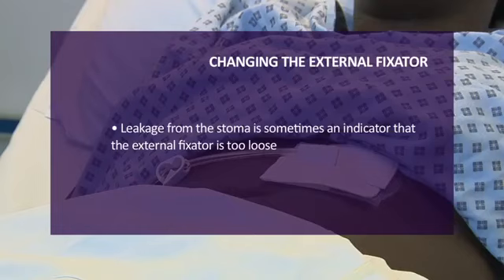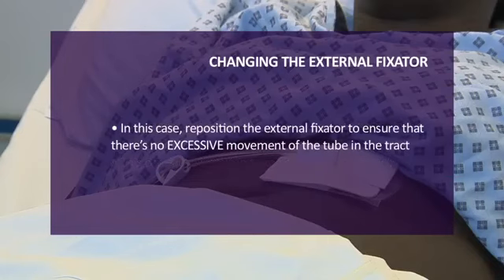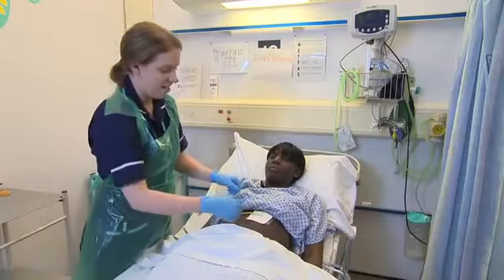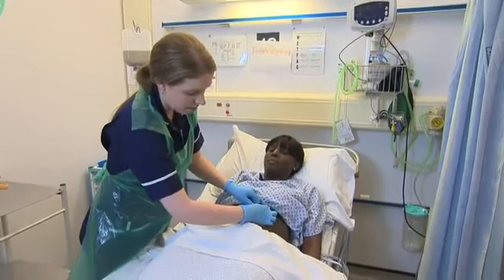Leakage from the stoma is sometimes an indicator that the external fixator is too loose, allowing gastric contents to escape. This can cause irritation to the stoma site and tract. So, if this happens, reposition the external fixator to ensure that there's no excessive movement of the tube in the tract.